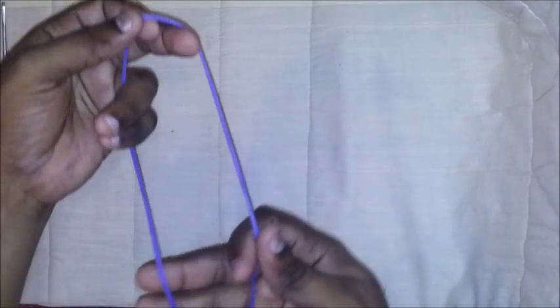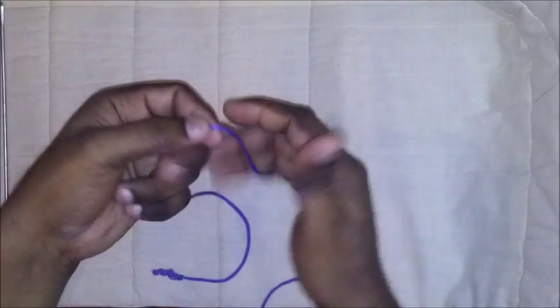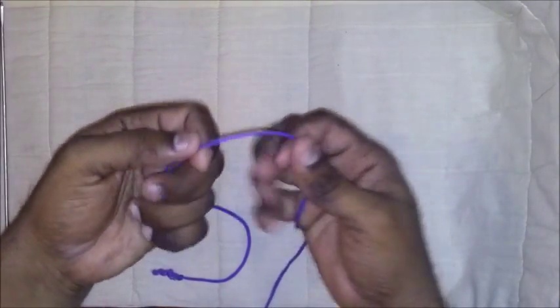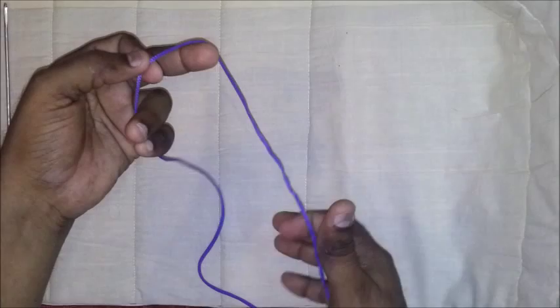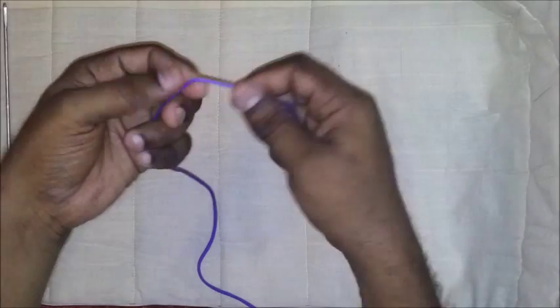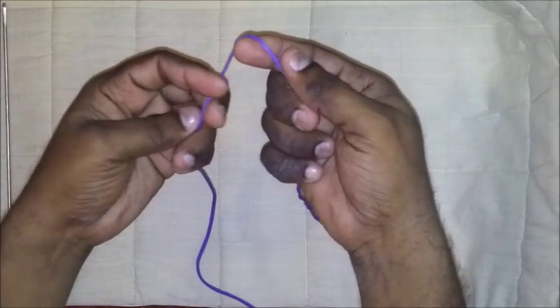I will demonstrate an extracorporeal knot which we use in laparoscopic surgery. I will not use a system.